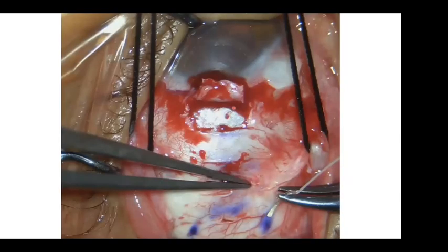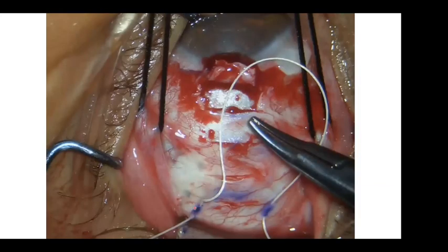So now, before I proceed forward, I put the sutures of the implant. So they are like pre-placed sutures. Sometimes we put the implant and then we go for the scleral sutures of the implant. But I'm working posterior, like 12 millimeter, which is not easy. It needs a bit of training for me and for the assisting scrub nurse as well. So nowadays I place the sutures before I proceed, and then I put the other suture, and then there is a loop which I cut, and then we have two sutures. So I do that before putting the implant. This facilitated things for me.